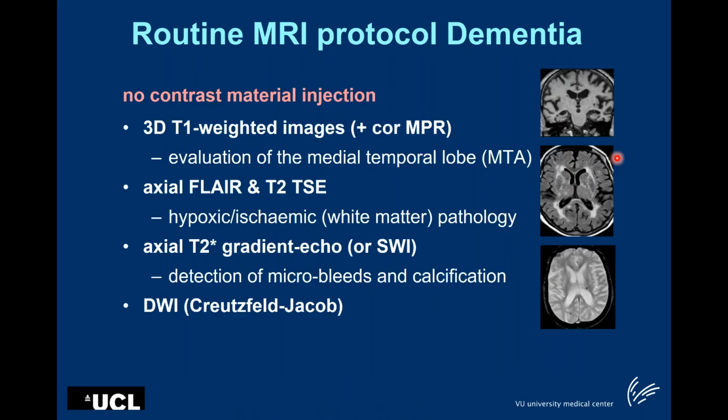Here's the routine MR protocol for dementia. So routinely, we do not inject contrast materials and no gadolinium.